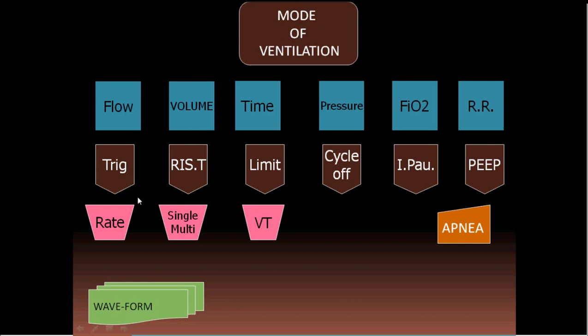When it comes to the rising time, when the patient triggers, the ventilator starts to deliver by rising time, how fast to go to this pressure. So the accelerated flow, you set a time, a shorter time, 0.1 second, 0.2 second, 0.3 seconds. So how fast will the flow go against the resistance and compliance to reach this set pressure? So this is the rising time, and the limit, what's the limit here? This is the pressure, so we go directly to this pressure.